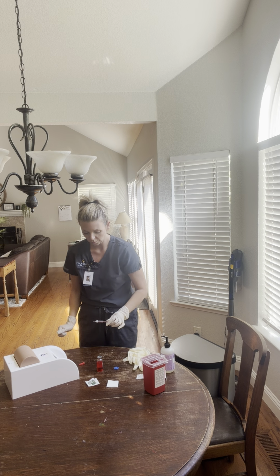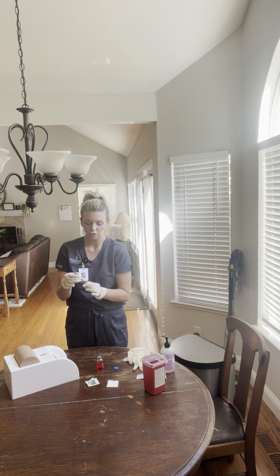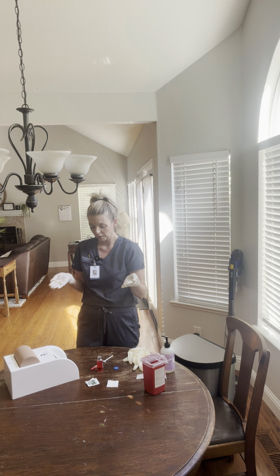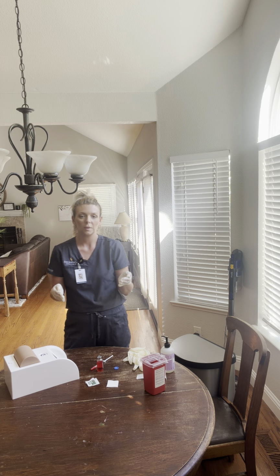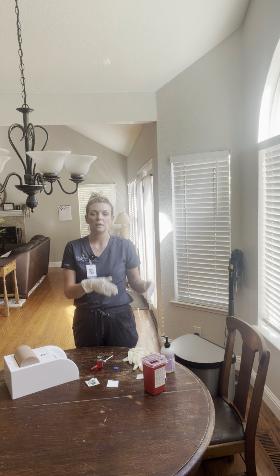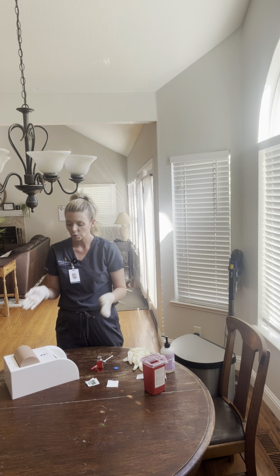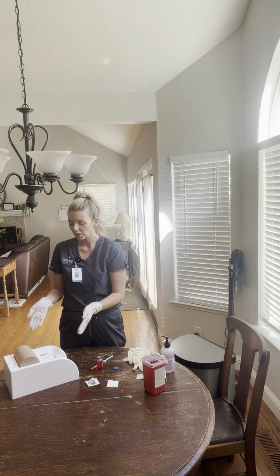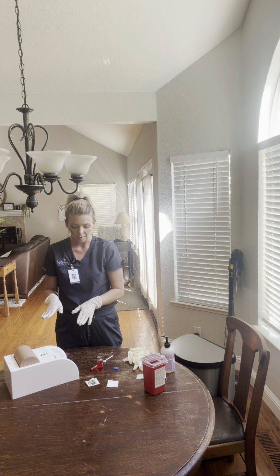And using the 1 scoop method, I'm going to cap my needle and make sure that that is ready to go. So before we do our injection, I need to find my injection site. A subcutaneous injection can be done on the upper thigh, the lower abdomen, or the back of the arm. Today, I'm doing the lower abdomen. So I'm going to inspect my site, see what the skin integrity looks like. Everything looks good. There's no bruising or rash or open wounds, nothing to be concerned about.